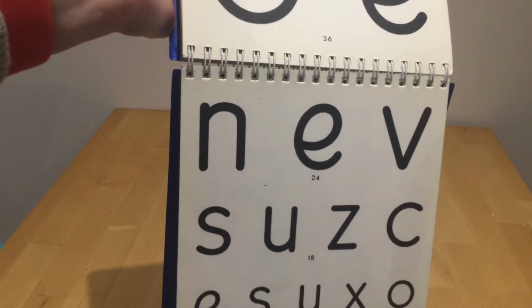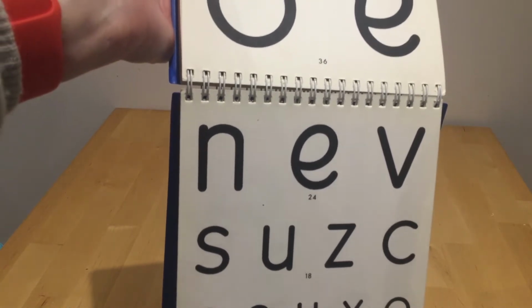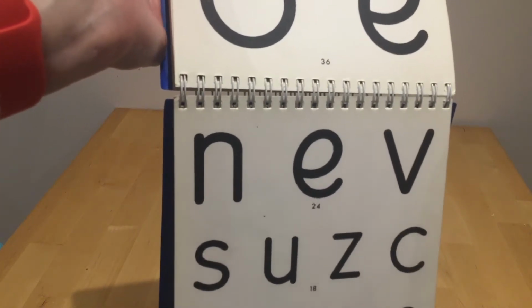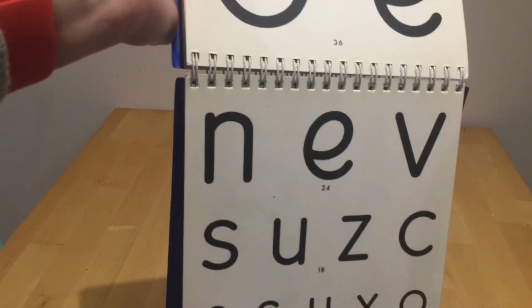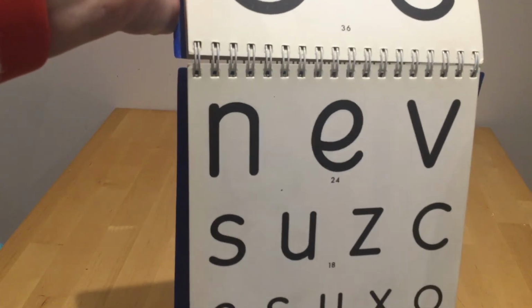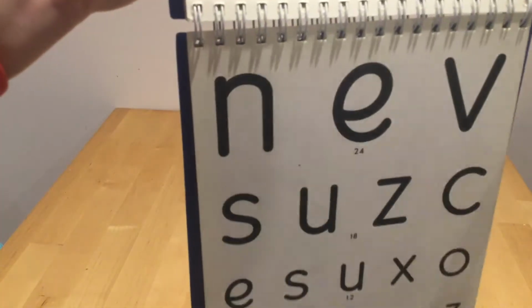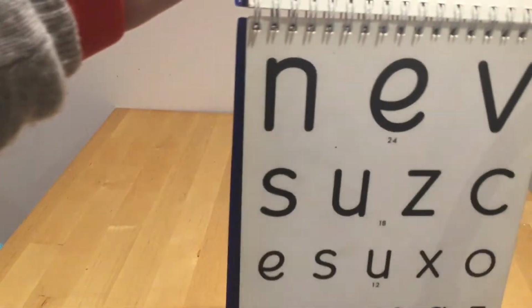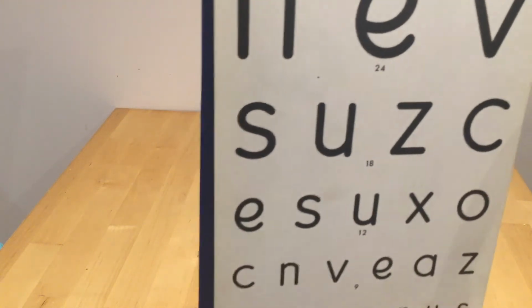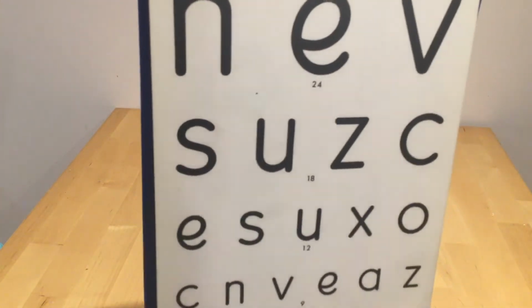And there will come a point where they're either moving forward, bending forward, or they try and take a step forward. And you have to tell them to go back and to try that line again. Always finish the test off on a line that they are able to read successfully. I should have said that for the near vision test as well. Always finish with success. That's important.